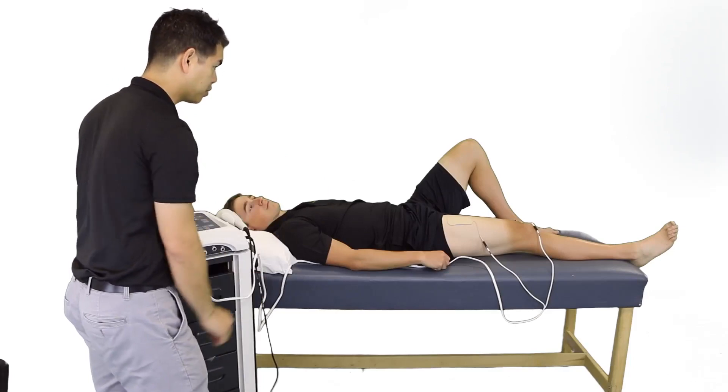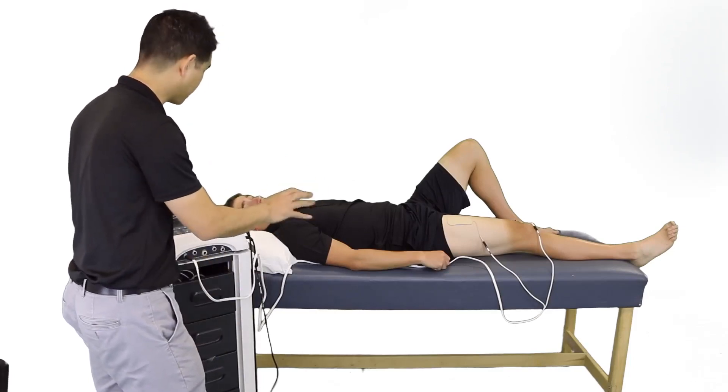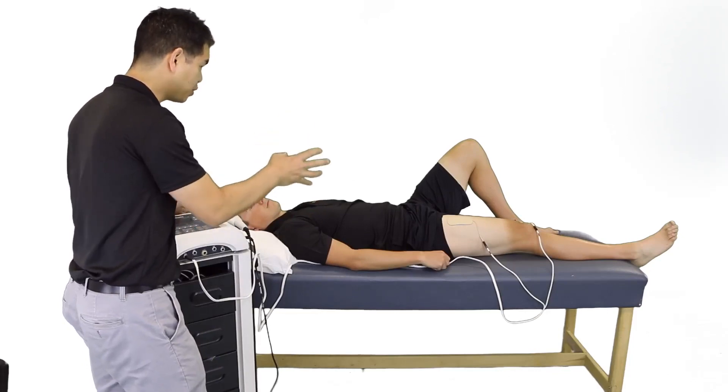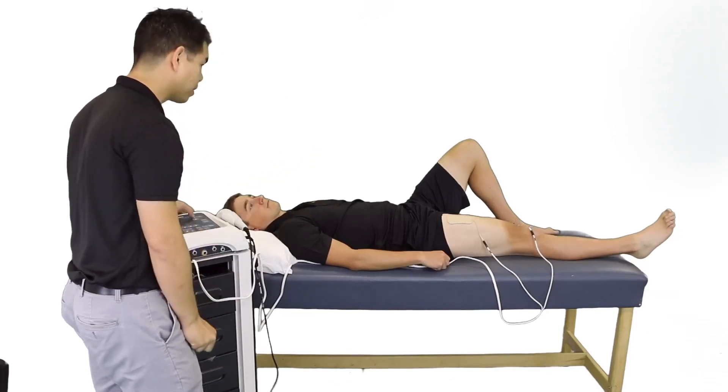Okay, so you're beginning to see the muscle contraction there. Is that comfortable for you? Can you tolerate more? You can go ahead. And when you feel that, I want you to actually activate your muscle with it.